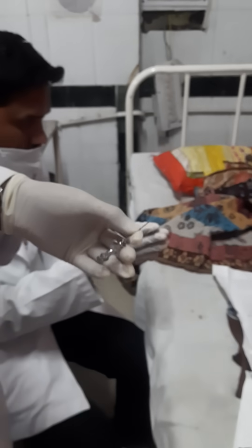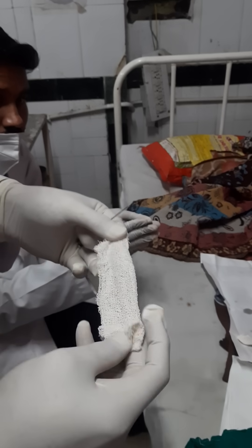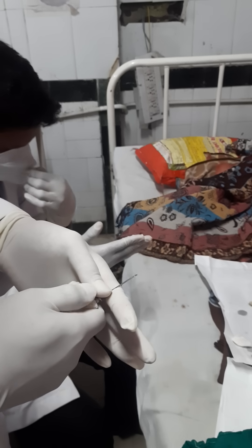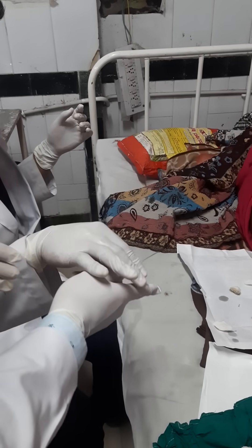Now you will hold the needle, usually with the help of some gauze piece so that it will be easy to hold. Then we will insert it into the bone now.